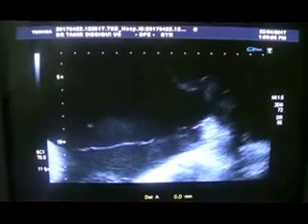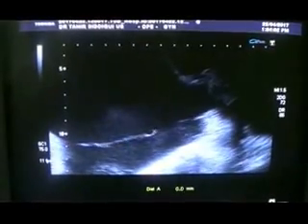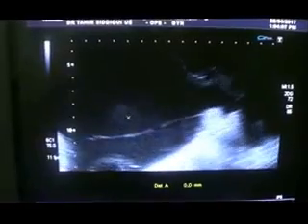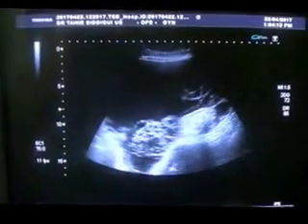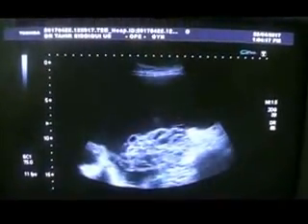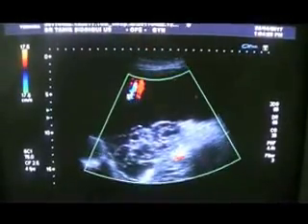has echoes. You see low-level floating echoes with flapping septa. This is a complete thick septa, and it is flapping. You can see the movement of the echoes. Now this is a bunch of septa seen within this fluid-filled cystic area.